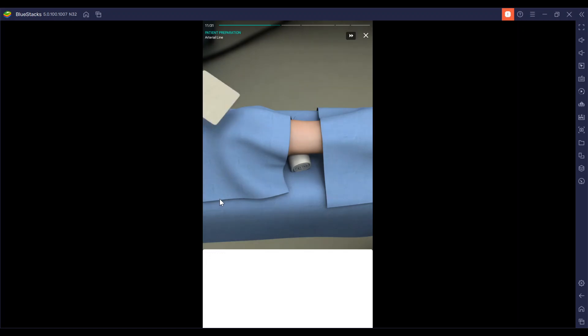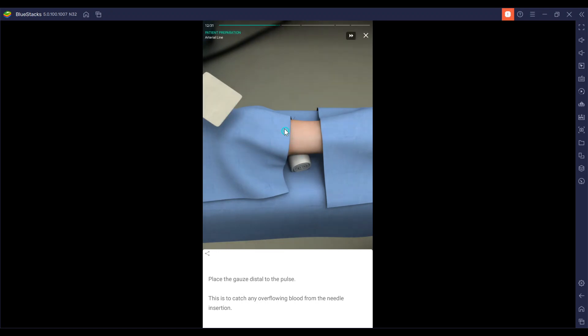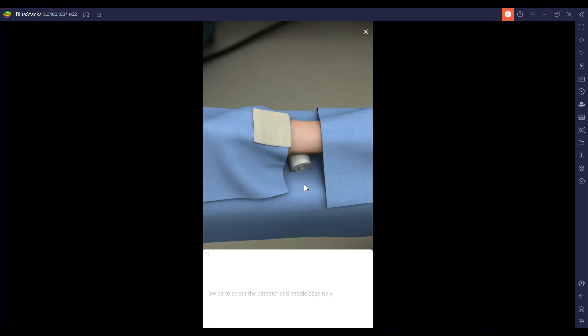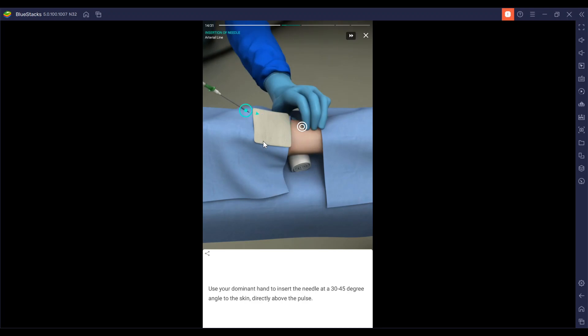I'm going to grab a sterile gauze and place that gauze distal to the pulse. This will catch any overflowing blood from the needle insertion. We're going to select the catheter and needle assembly and using your dominant hand, you're going to insert it.